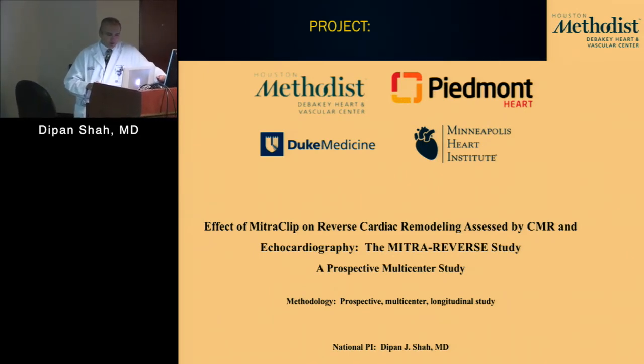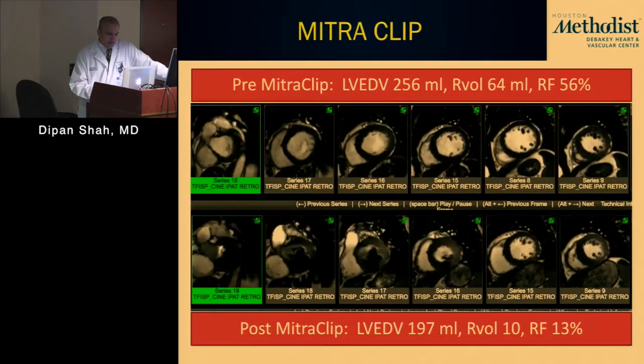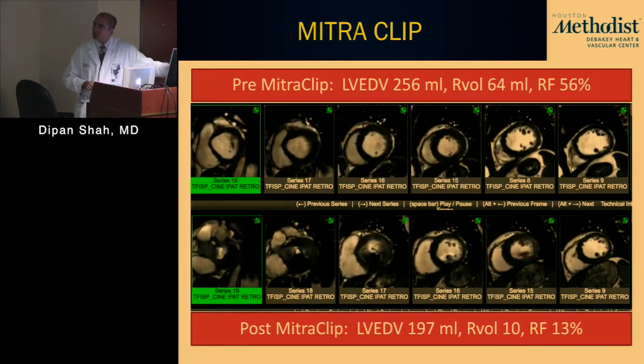We picked 4 sites for this study. And again, we're looking at patients that are getting MitraClip implantation, patients that are high risk for mitral valve surgery, that have primary mitral regurgitation. And I'll show you a couple of examples.